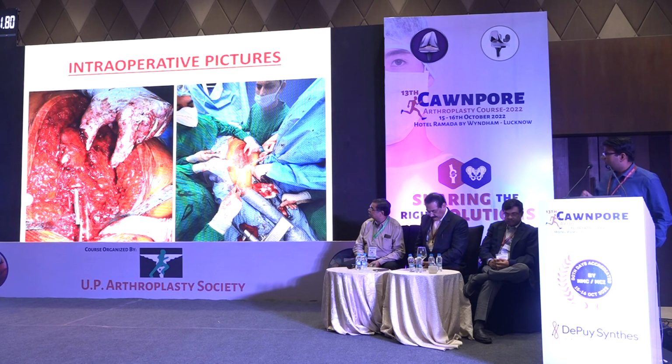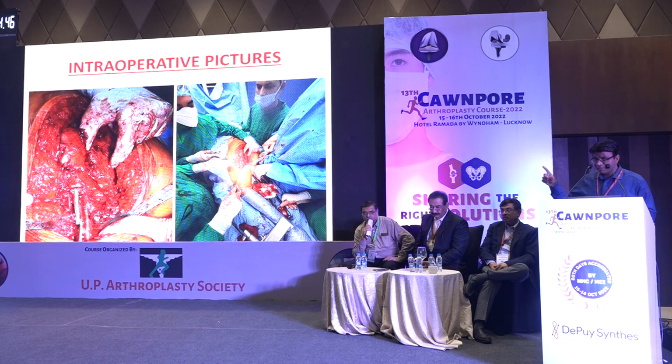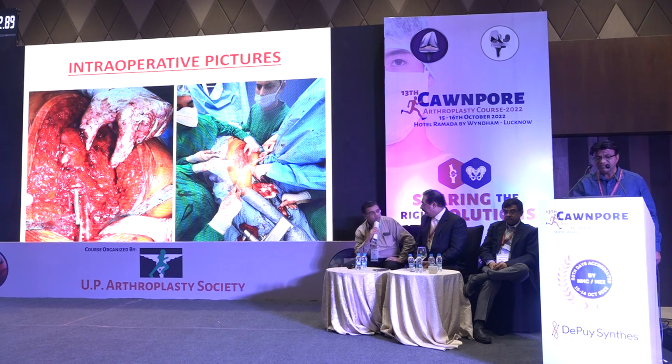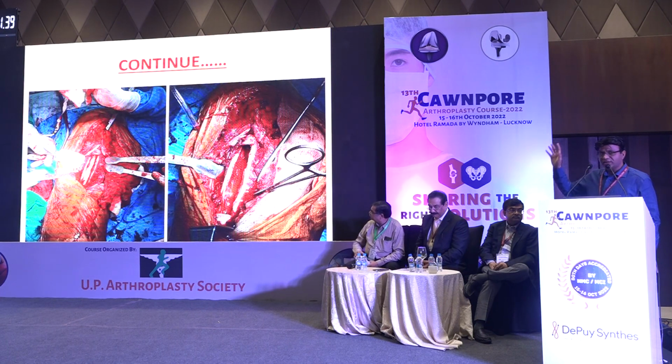So in this case, because of severe osteoporosis, I avoided ETO. I made a window starting from the distal part of the broken implant and extending 3 centimeters below the distal part of the broken implant. With that rectangular window, I was quite comfortable. I was able to remove the broken implant with cement comfortably. In this case, I didn't do extended trochanteric osteotomy. This is how I made the window. Because of the osteoporotic condition, I avoided ETO in this case.